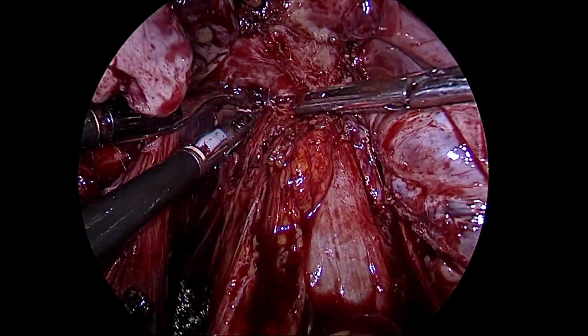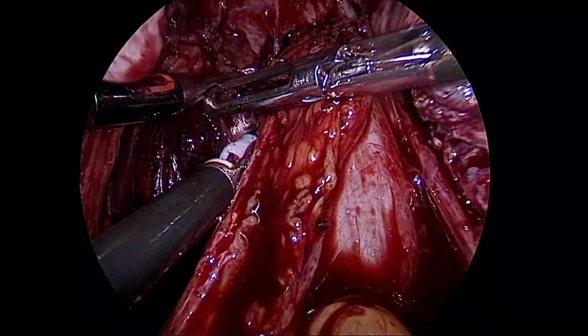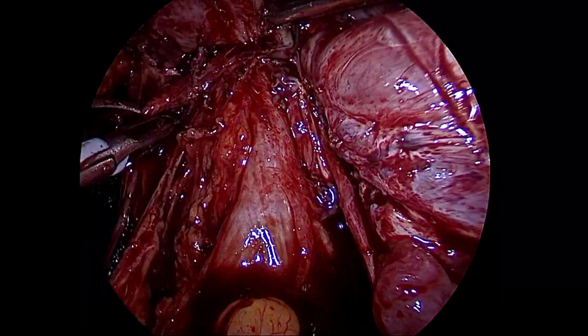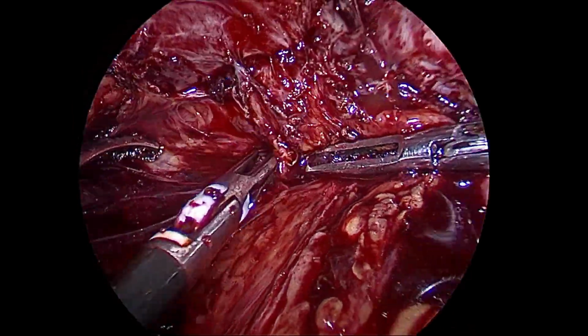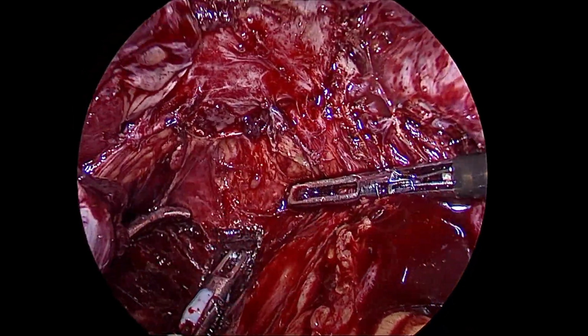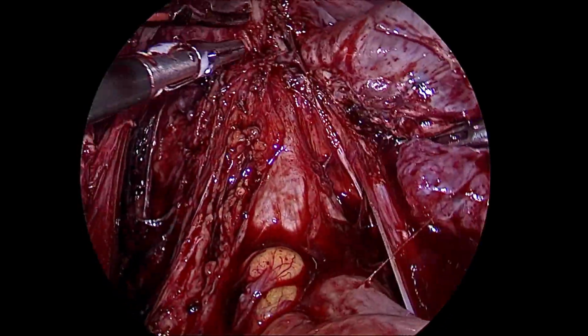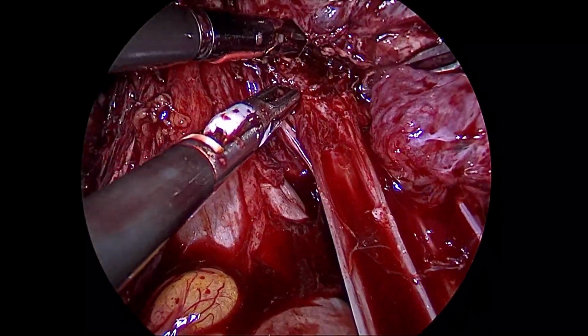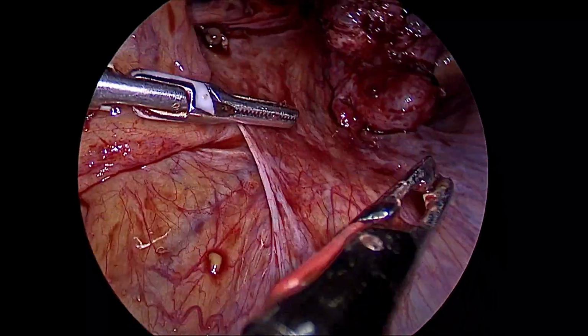As you can see, these are the pararectal adhesions to the POD that we are dissecting out, and they are put in the normal anatomical position. With just a short microsecond burst of energy, in case there is bleeding, it is controlled.